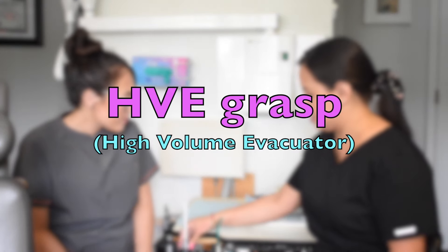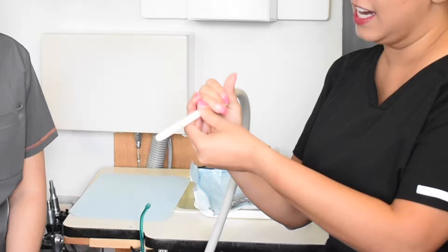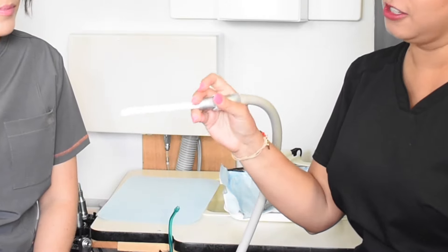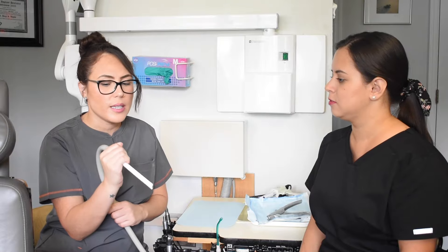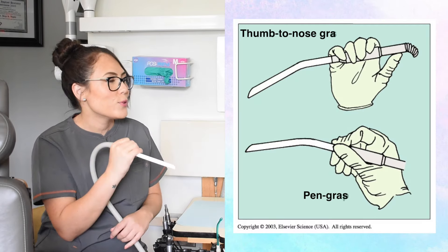For the high suction, this is where you get all the control — right here where you have the lever. You've got to find a position where you have a finger available that you're opening and closing it, and keep that grip on that area because that's where there's the most weight and you can control it. I would hold it like a pen and use my thumb. You can turn it on and off with your thumb or even your index finger, and you have full control.